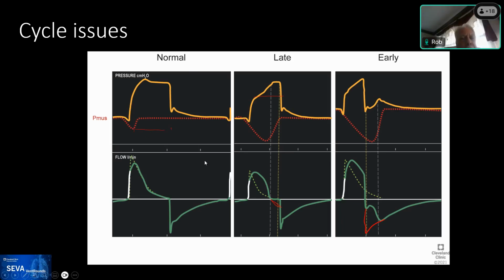All right, so here's the patient that I saw this morning as I was walking through the unit. And we're going to walk through this in a classic pathway, starting with the tag. And again, I'm not hiding any information as we go through this. So the first one is, what's the tag?